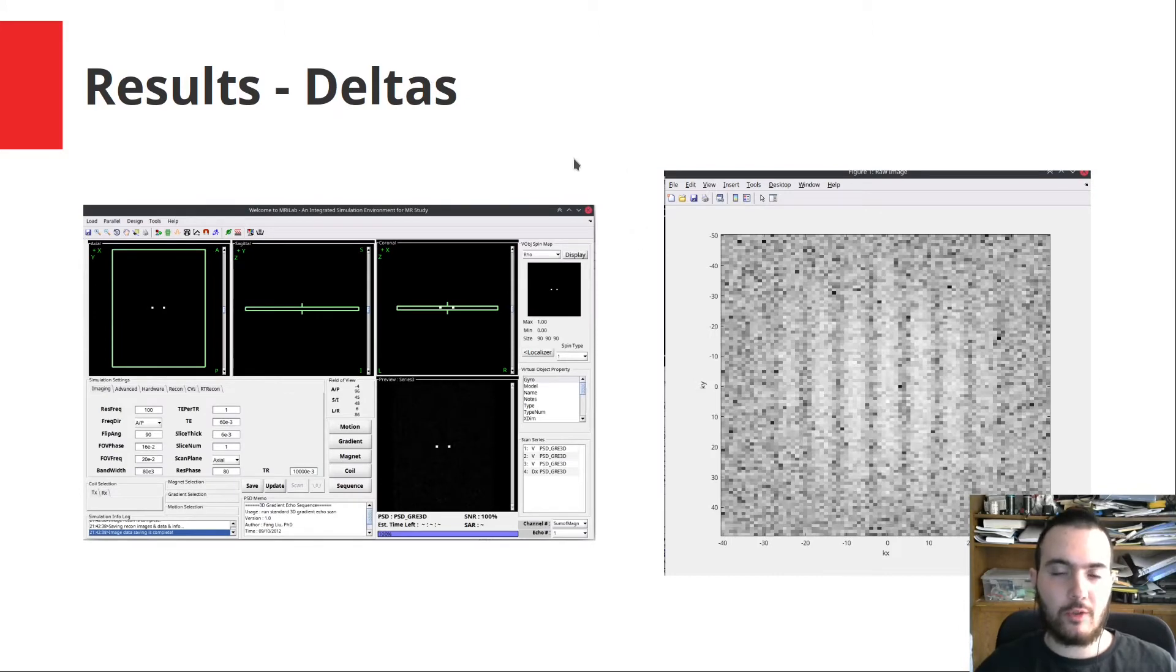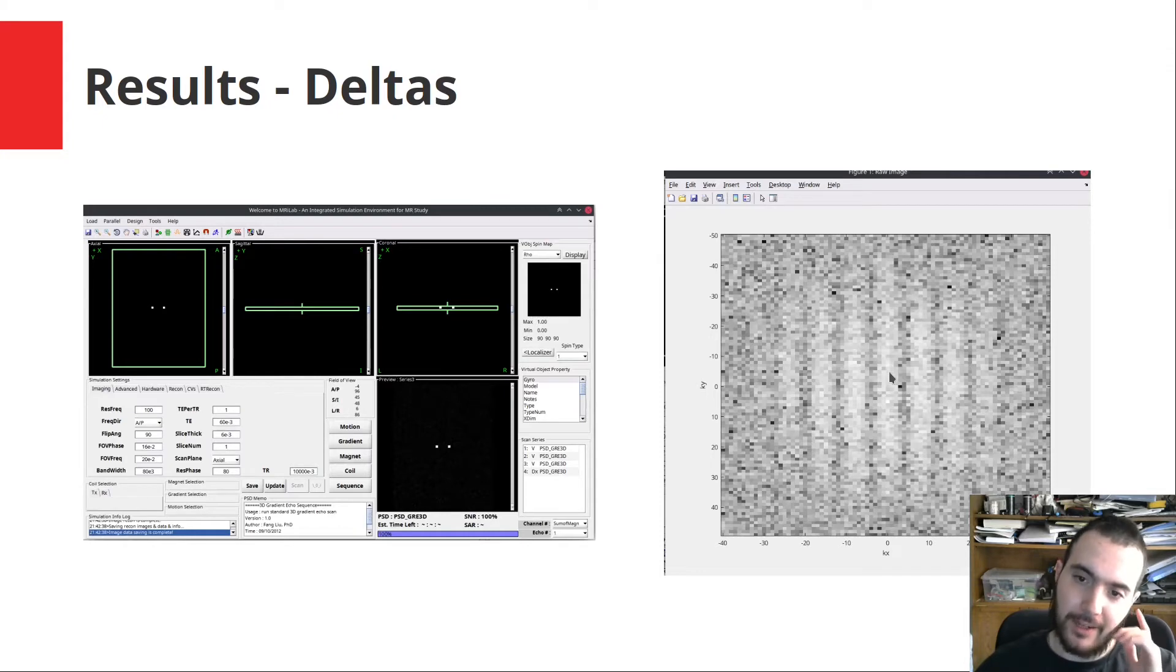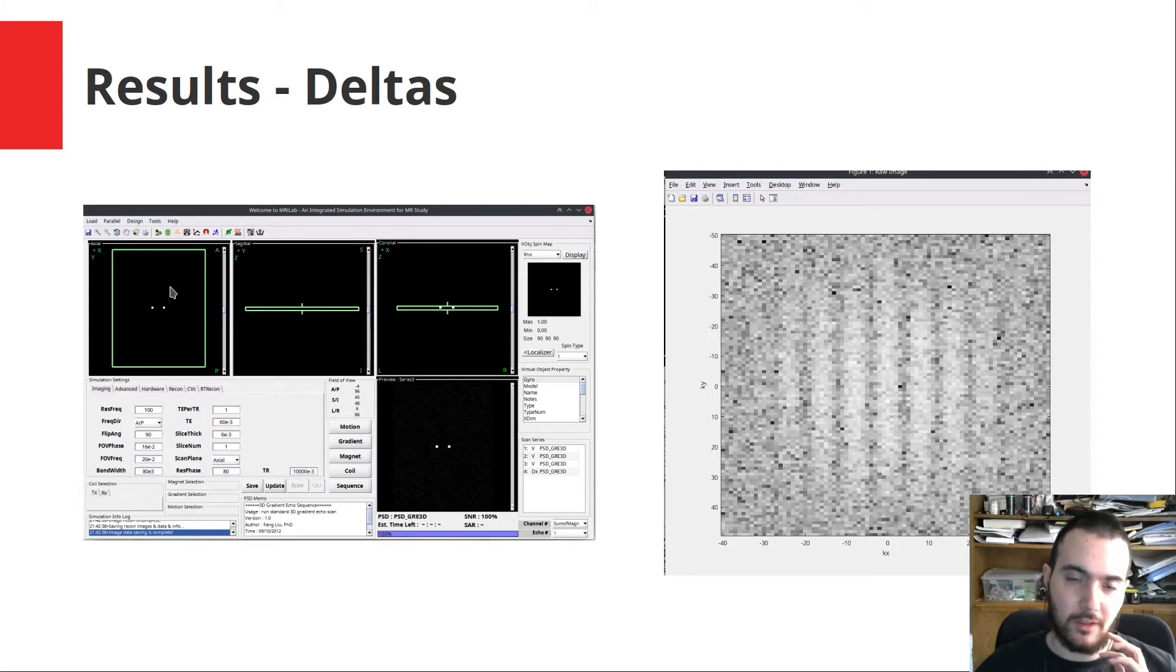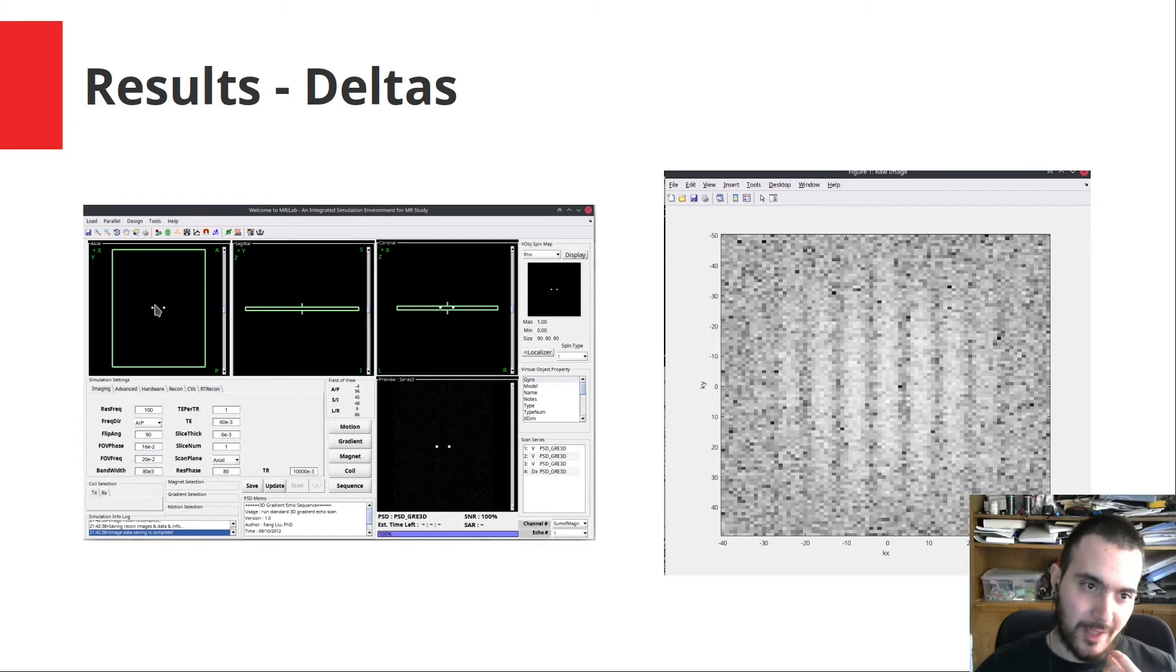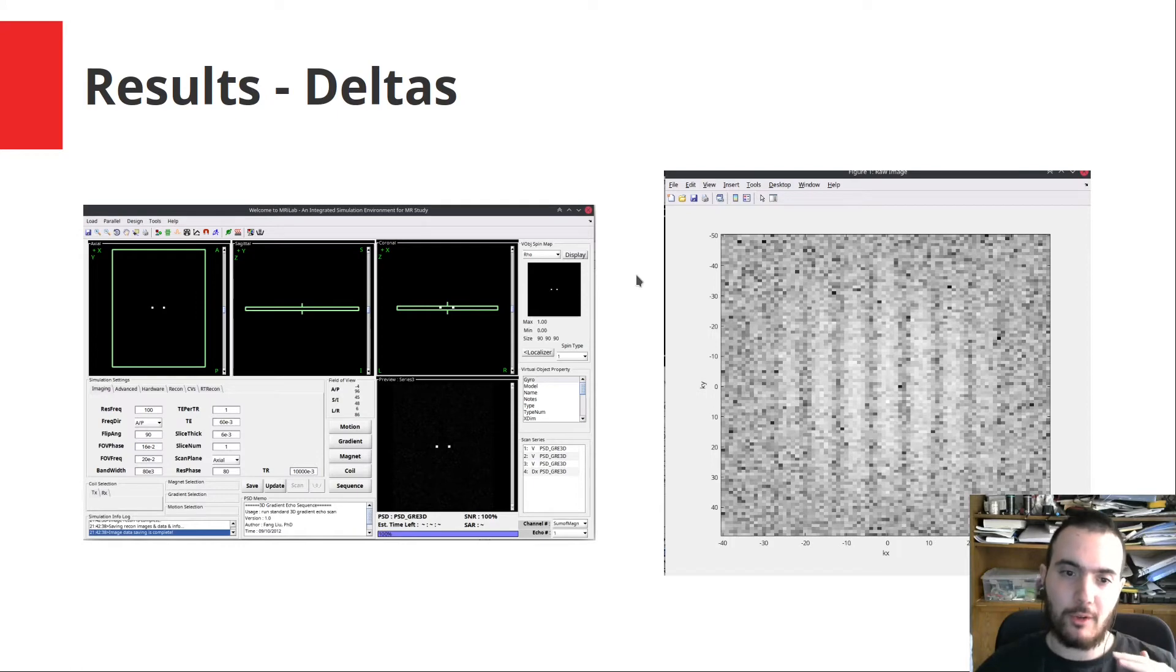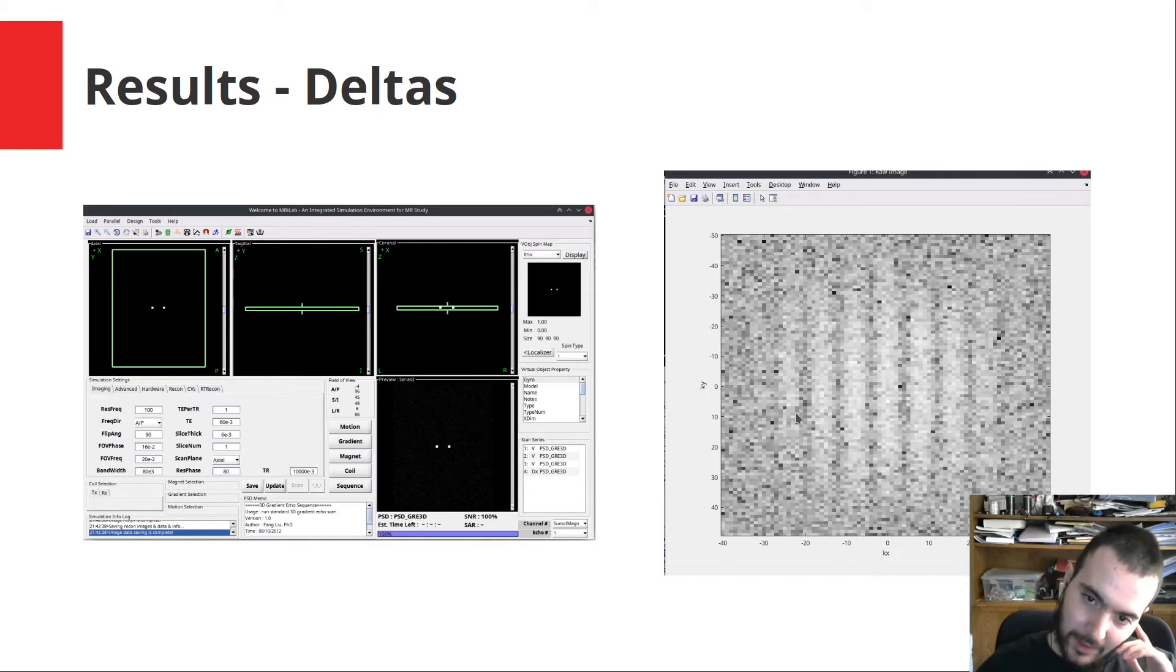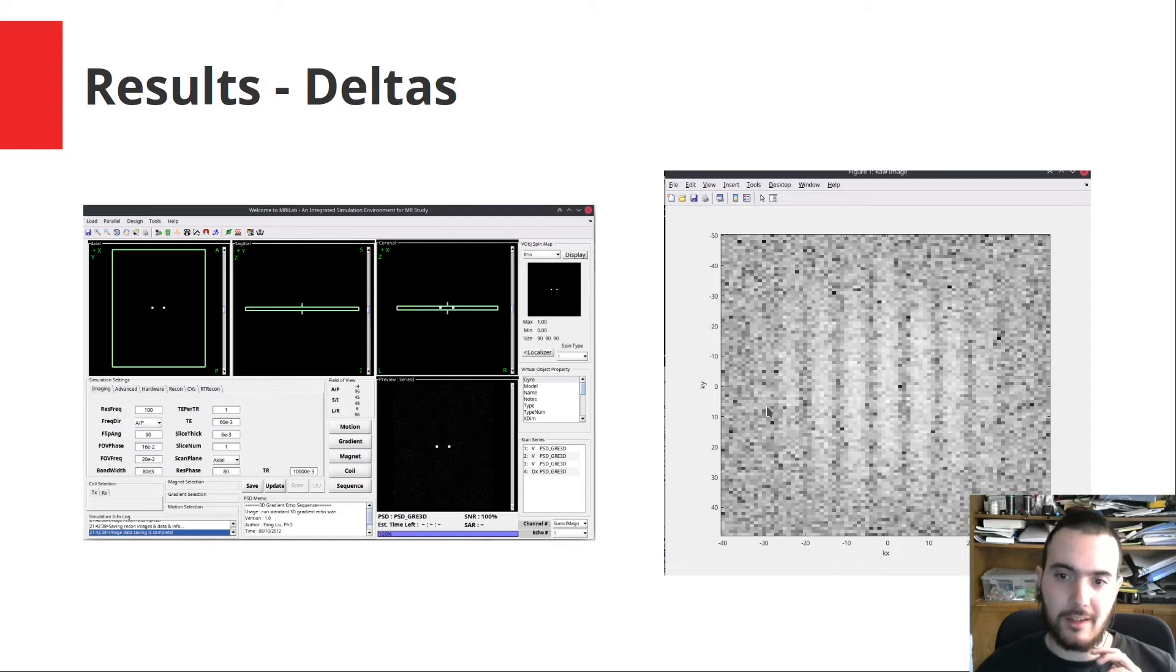I also tried to have a sine wave in the k-space, which would correspond to two delta functions in the real space. But to make delta functions, you have to have very small objects, and then this results in the received signal being lower in magnitude and slightly above the noise. So most of what you can see is noise, but we can also differentiate these stripes between. Ideally this would be black, white, black, white like a striped view, but this is basically a sine wave with the noise added in.